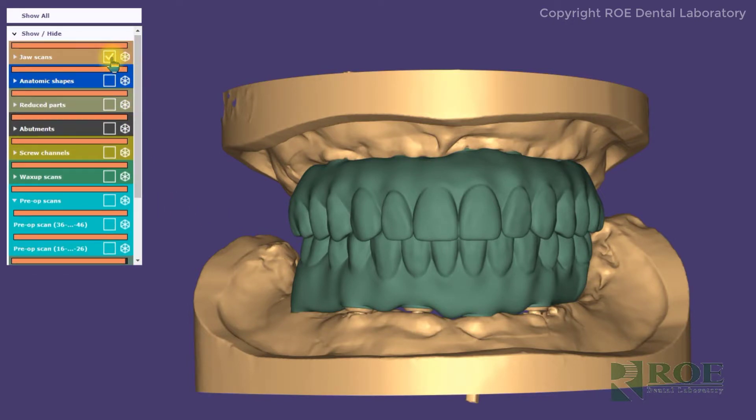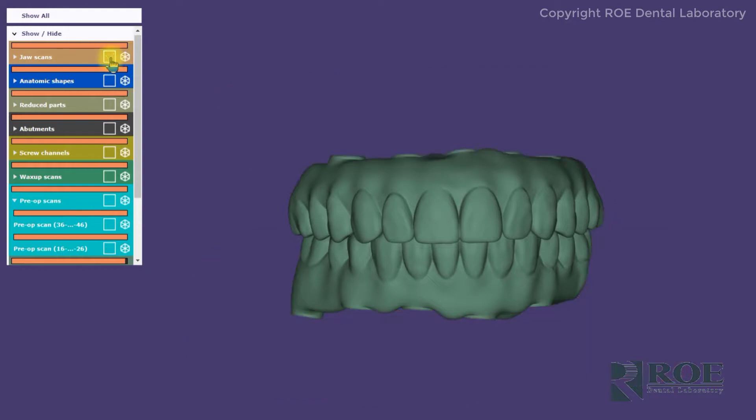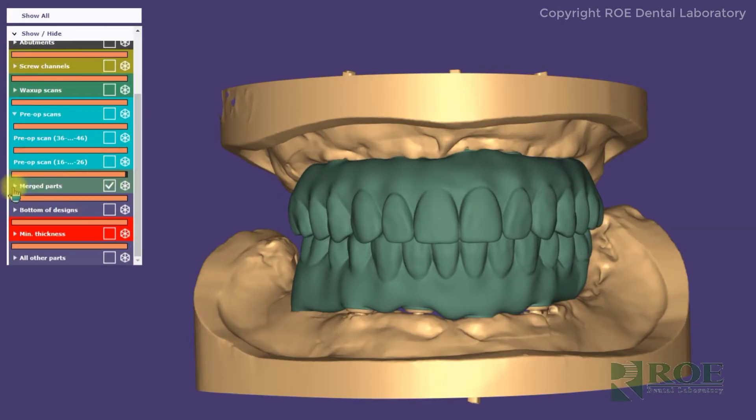And then finally the jaw scans, which are essentially the upper model and the lower model, as you can see here on this toggle. With each of these toggles you have the ability to turn down the little arrow, and then you can toggle back and forth to make it more or less transparent.